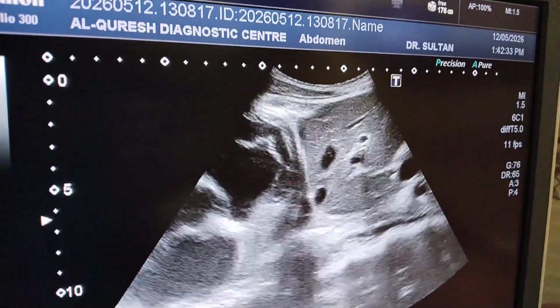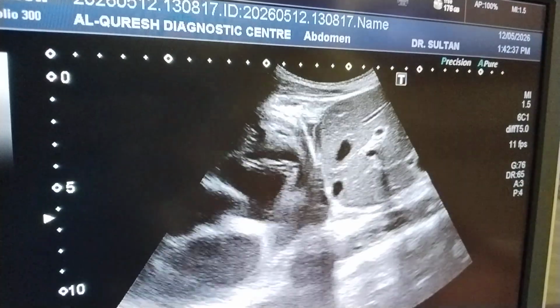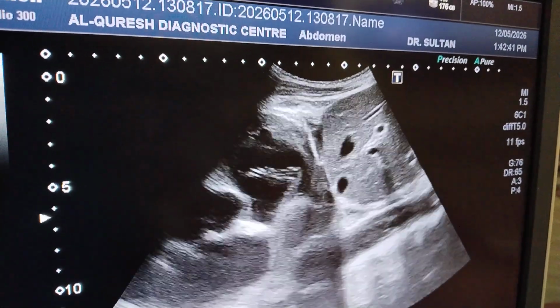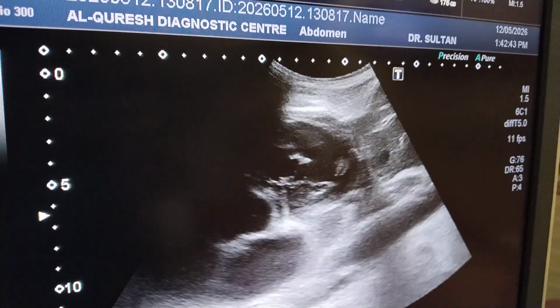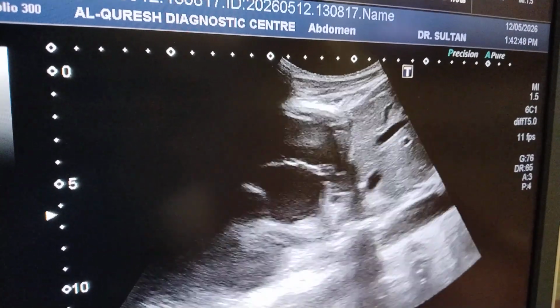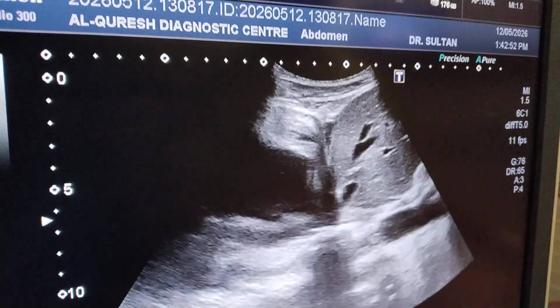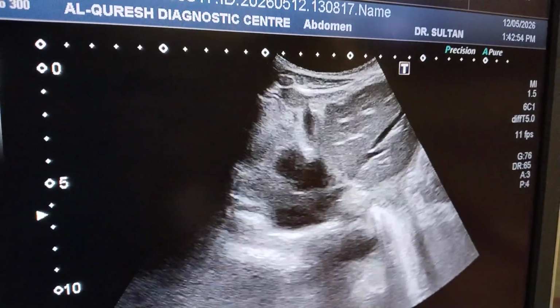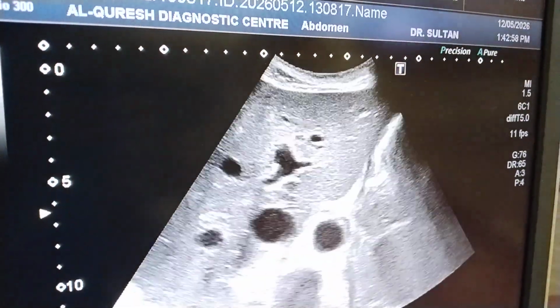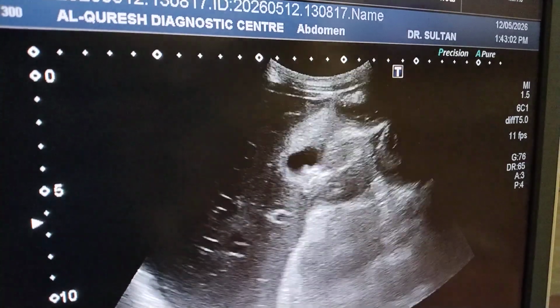And when we see the mitral leaflet, they are not going to touch the interventricular septum, which is seen in the normal functioning heart. So it means that systolic dysfunction is also present. So this was somewhat about this finding which we have seen. So now I am going to see other things.